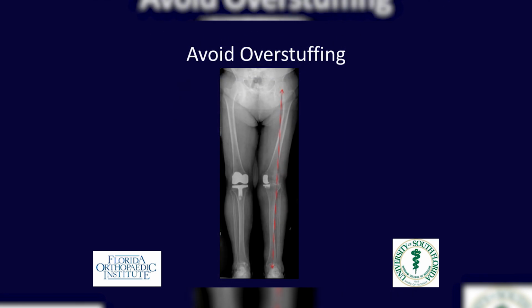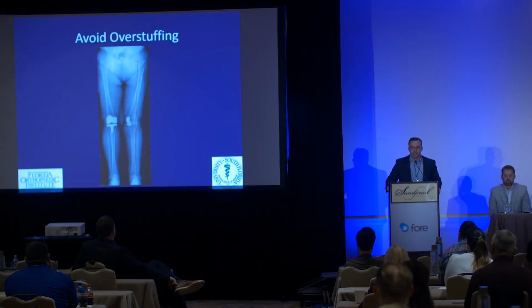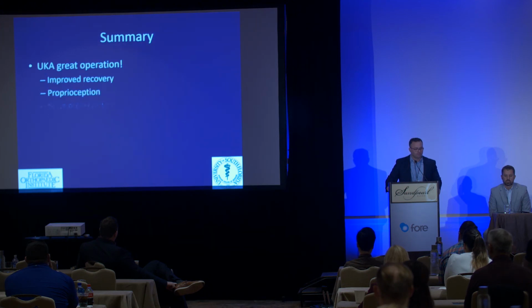Last point here, technically, when implanting these components, if you overstuff or make that compartment too tight, it can translate those forces to the contralateral compartment, resulting in early wear and a progression of arthritis. So it's something to be cognizant of.